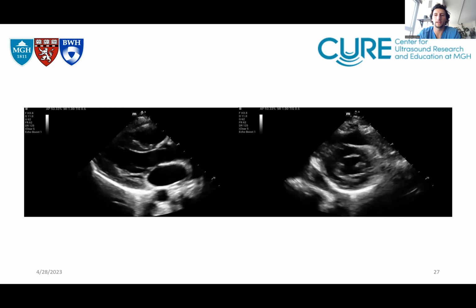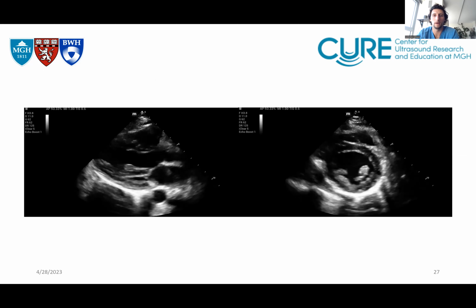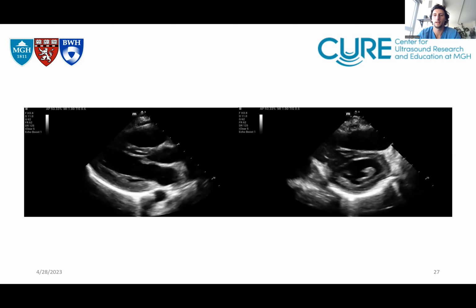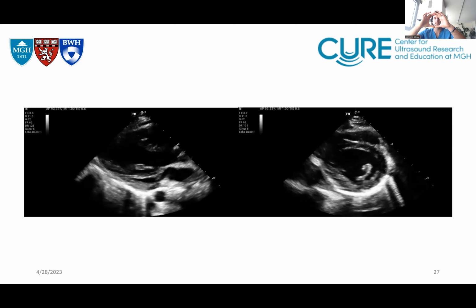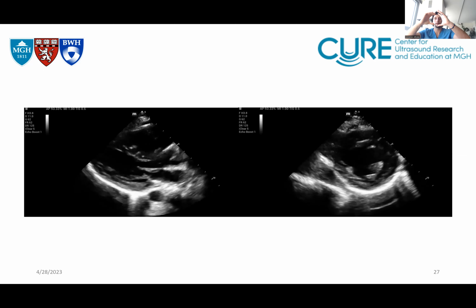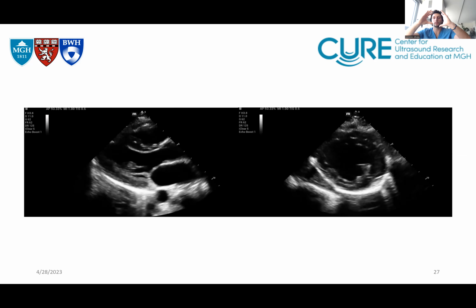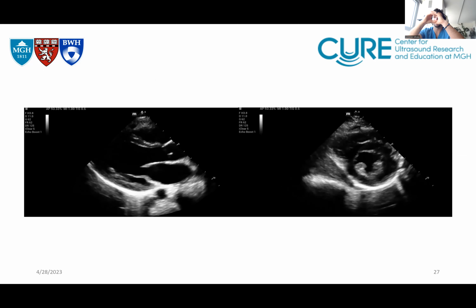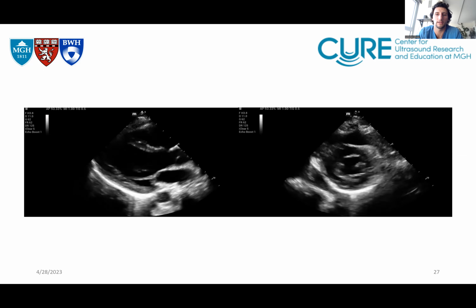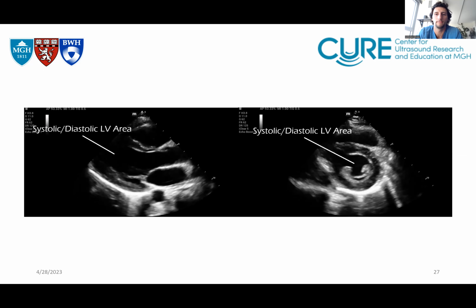And so when you take a look at the cross-sectional view of this normal heart, this is what a normal looking ejection fraction looks like. All the sides of this concentric circle are thickening as they contract pretty symmetrically, and the area inside is getting smaller pretty symmetrically as well. So that looks like a good normal ejection fraction.